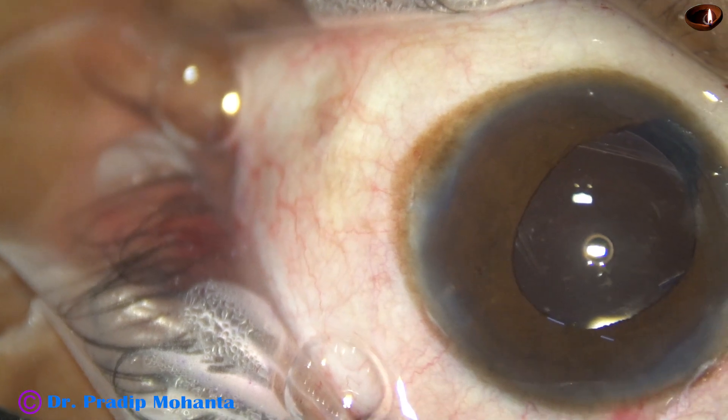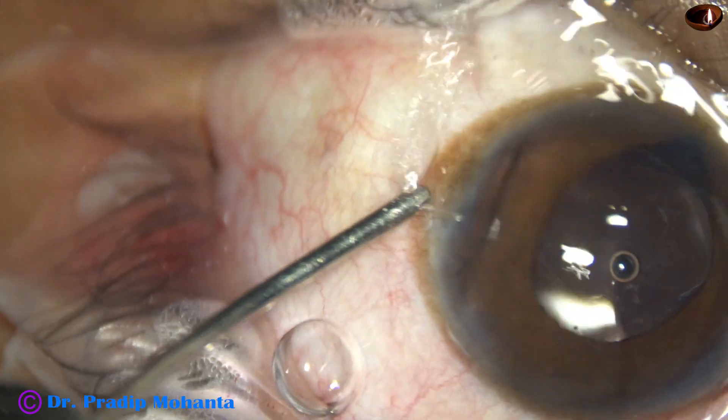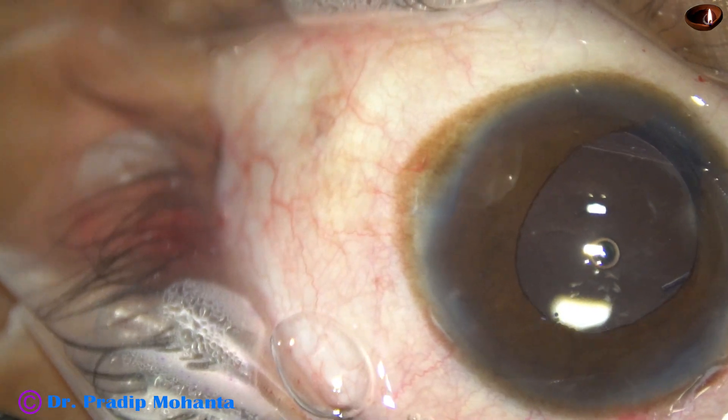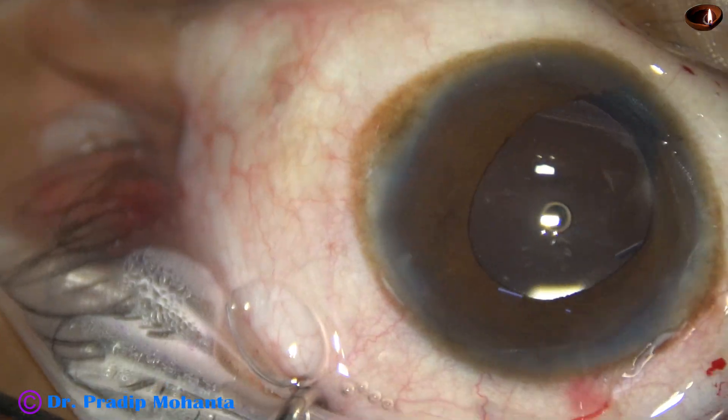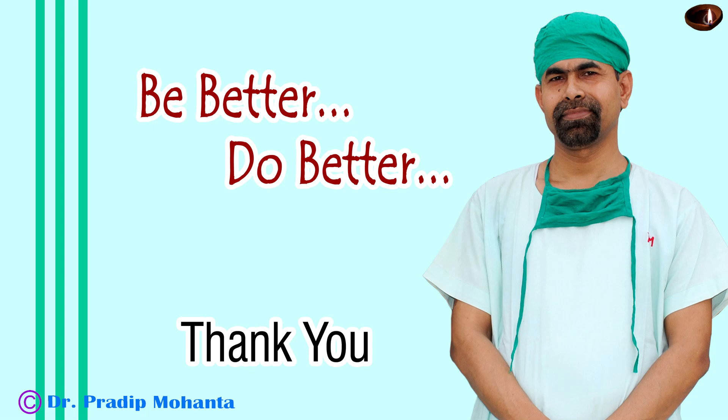This looks fine — we are towards the end of the surgery. The anterior chamber is nicely formed, integrity of all the wounds is checked, and the case is concluded. Thank you very much for your attention. Hope this video will help you in developing your surgical skills — be a great surgeon and serve your patients with love, respect, compassion, and great surgical competence.